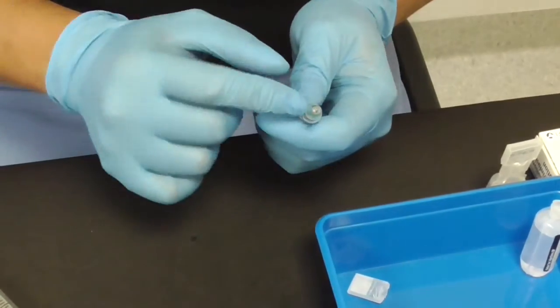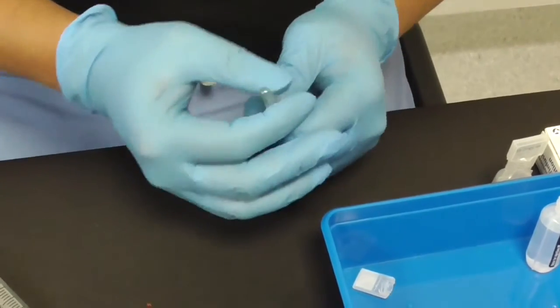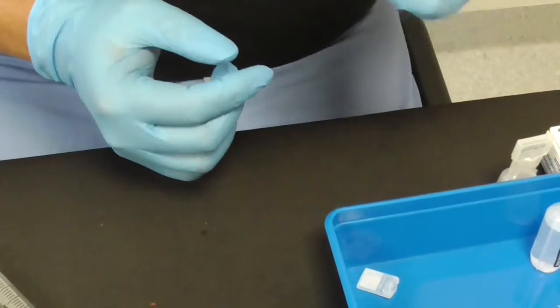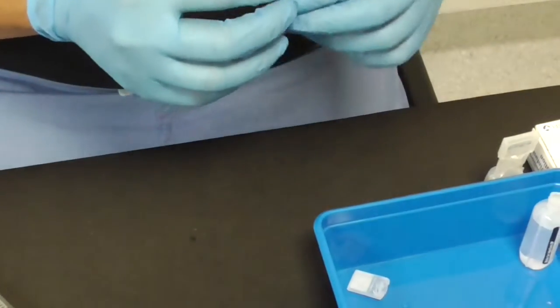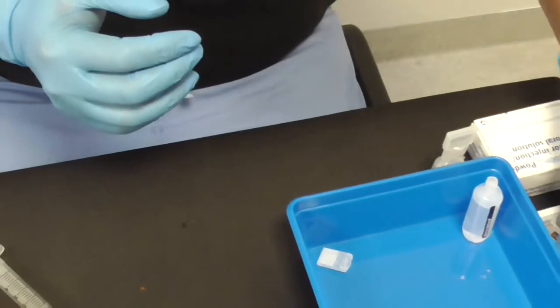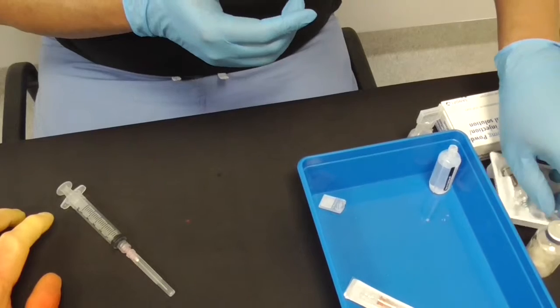Please be careful. You can usually cut yourself on the sharp edges of the glass vial. The reason for certain things being in glass vials is because the fluid doesn't do well in a plastic vial, and there's a bit of denaturation of either the plastic or whatever medication's in there.